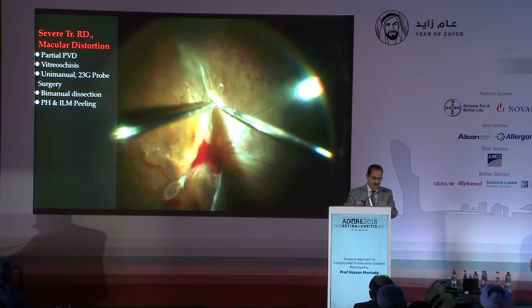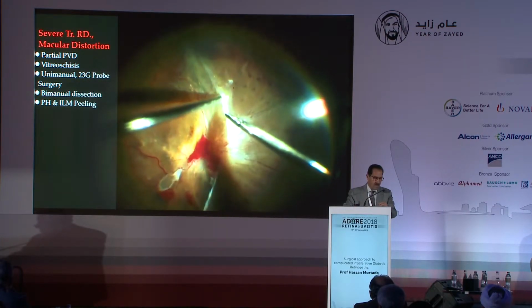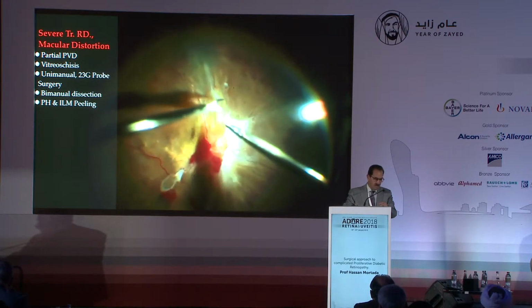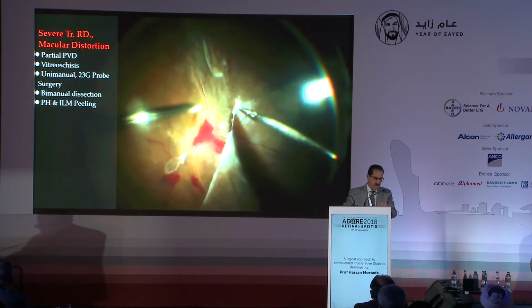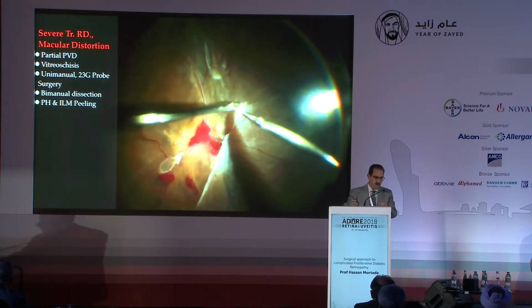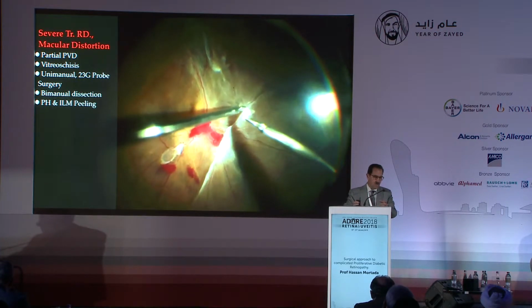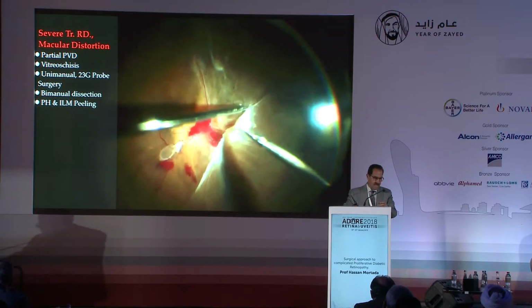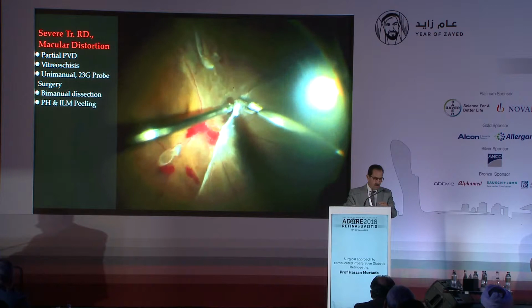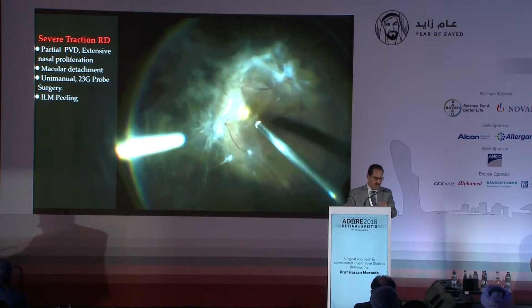probe. And then at last I found that these tissues cannot be managed with the probe alone, so I resorted to the bimanual technique with forceps and scissors, doing segmentation and delamination, working with the scissors closed, using it as a spatula, and when it is open to cut, it cuts the epicenters, and slowly the underlying retina becomes free from the traction exerted by the overlying fibrovascular tissue.